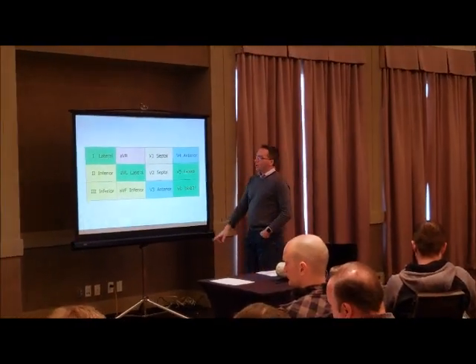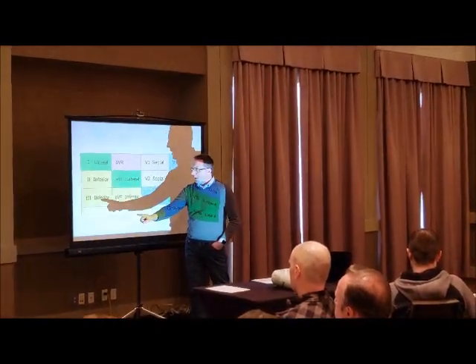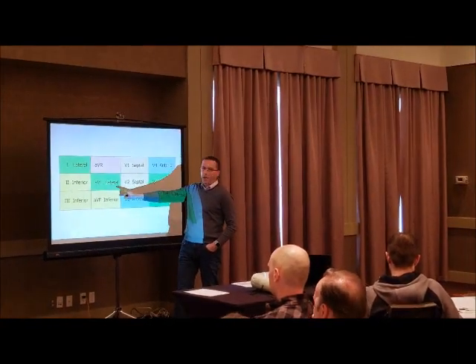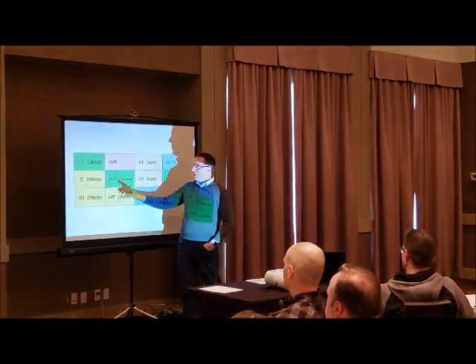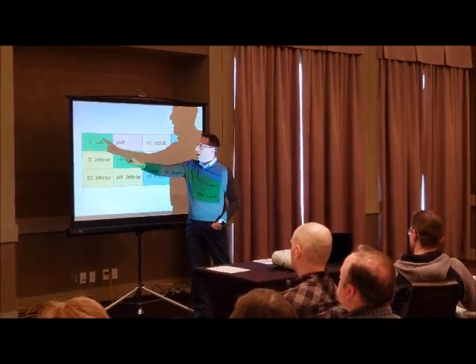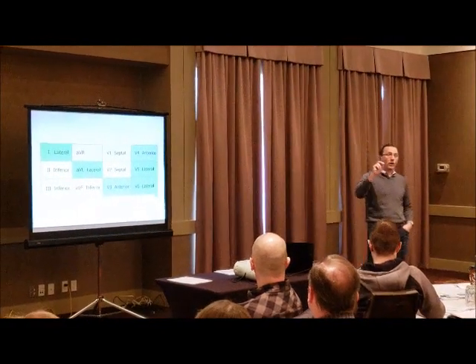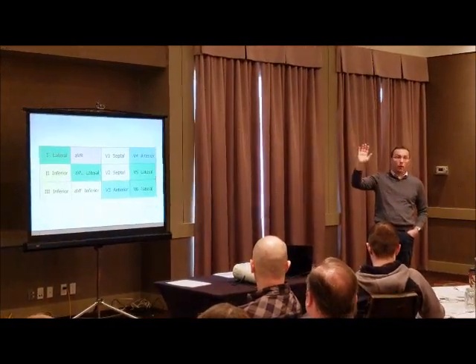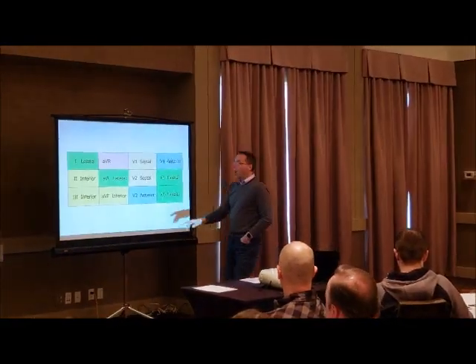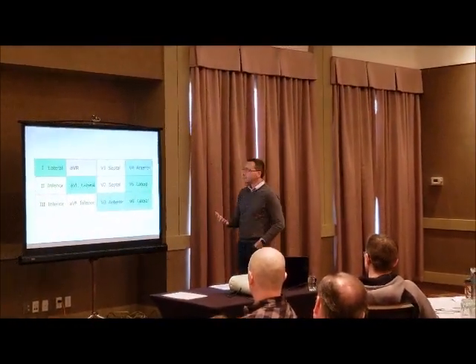The most reciprocal leads, as you will see on the 12-lead ECG, are AVL and lead 3. So if you have ST elevation in lead 3 and the patient's having a STEMI, you're going to see your reciprocal change here in AVL, sometimes lead 1, but your go-to lead is really AVL. Sometimes when you have ST elevation in the so-called high lateral leads, those are sometimes referred to as electrocardiographically silent leads. So high lateral STEMI tends to be really, really subtle. Sometimes the most impressive findings are in fact the reciprocal changes here in the inferior leads, and I'll show you some examples of that as well.